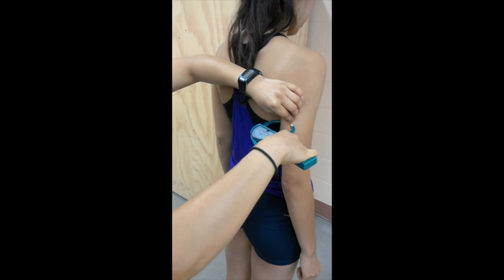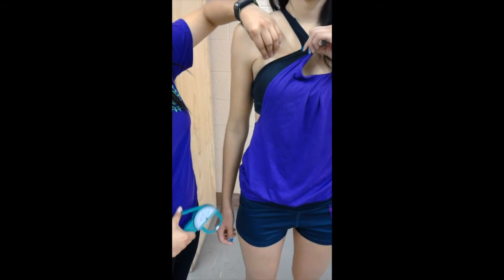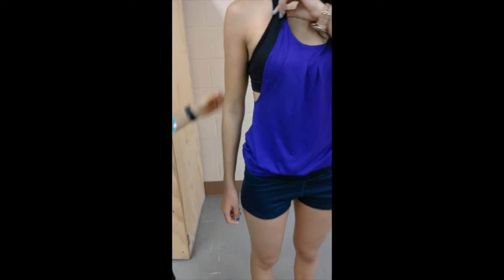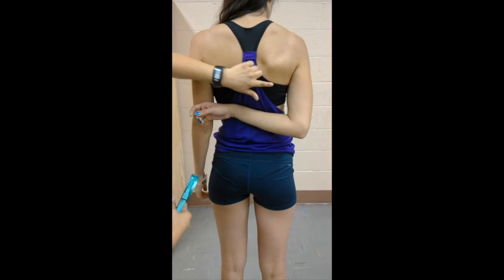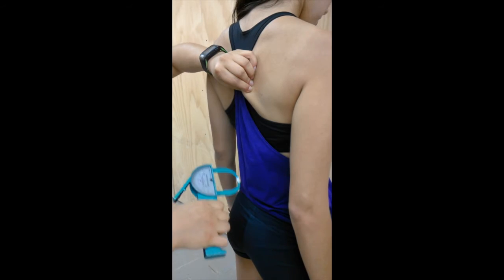The chest or pectoral site will be measured one-half the distance between the anterior axillary line and the nipple for men, or one-third of the distance between the anterior axillary line and the nipple for women, at a diagonal fold. The subscapular site will be measured 1-2 cm below the inferior angle of the scapula. Have your subject place their arm behind their back to identify the scapula, then fold at a diagonal 45-degree angle.